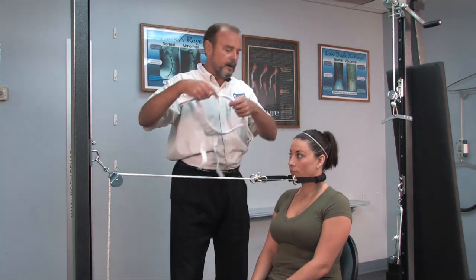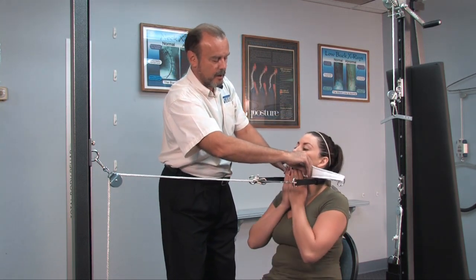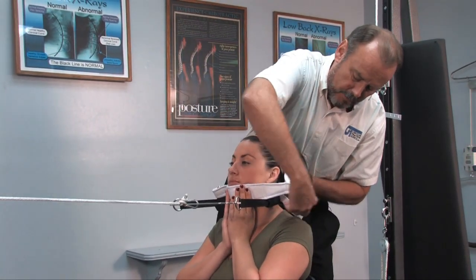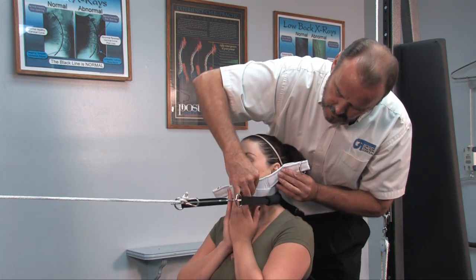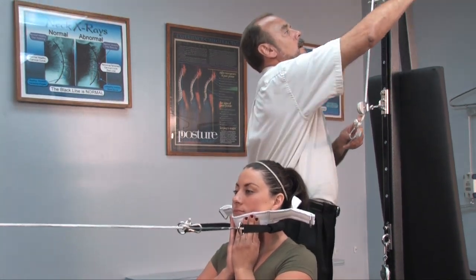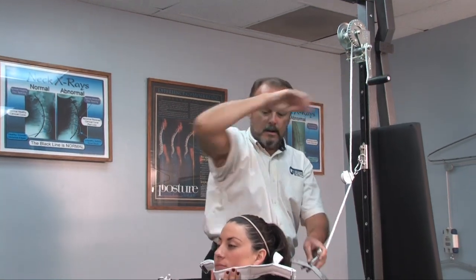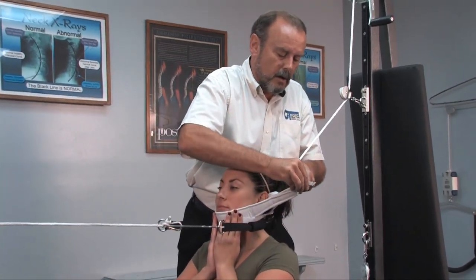All of these pieces are included with your unit. We're going to take the head halter, place that on her chin, and ask her to simply hold that right on her chin in the center. We're going to hook up on one side, hook up on the other side, right to the Velcro just like that. Then we're going to disengage that ratchet and hook up to this crossbar right here.